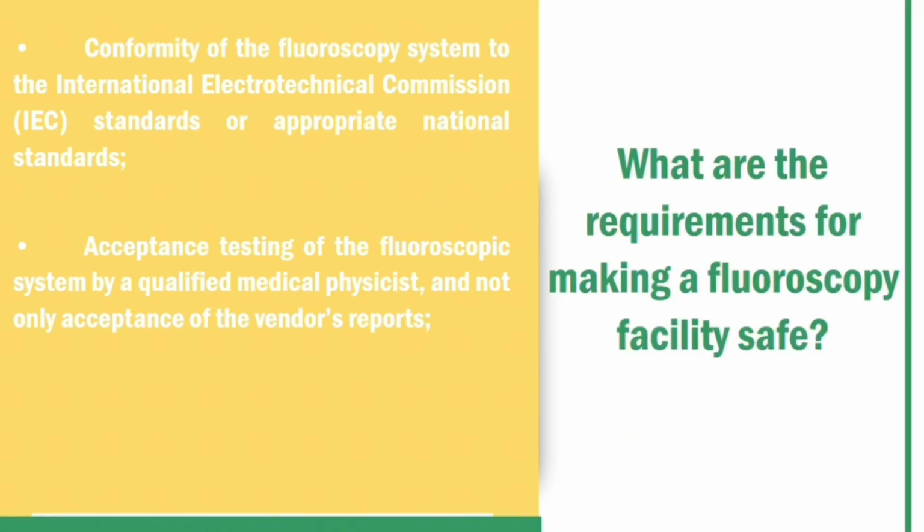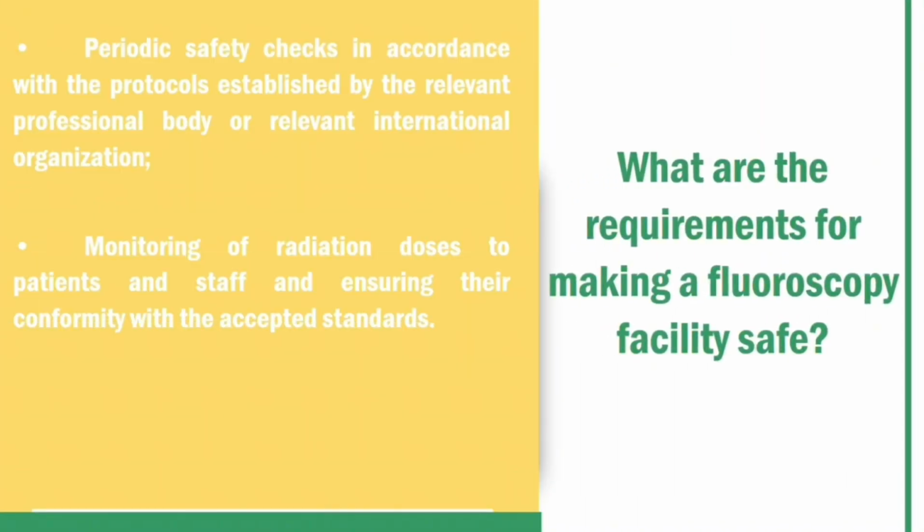Conformity of the fluoroscopy system to the International Electrotechnical Commission or the IEC standards or appropriate national standards. Acceptance testing of the fluoroscopic system by a qualified medical physicist, and not only acceptance of the vendor's reports. Periodic safety checks in accordance with the protocols established by the relevant professional body or relevant international organization. Monitoring of radiation doses to patients and staff, and ensuring their conformity with the accepted standards.